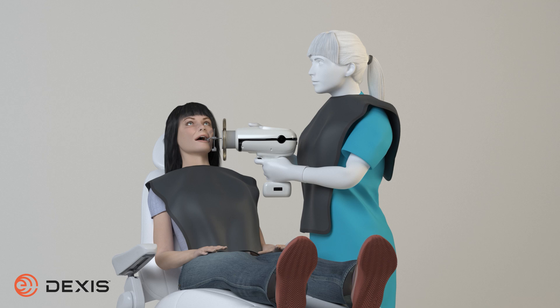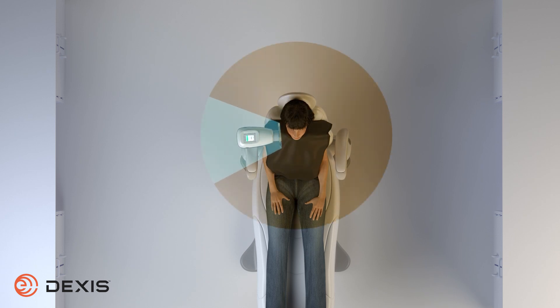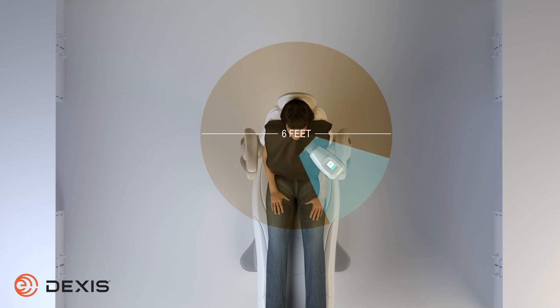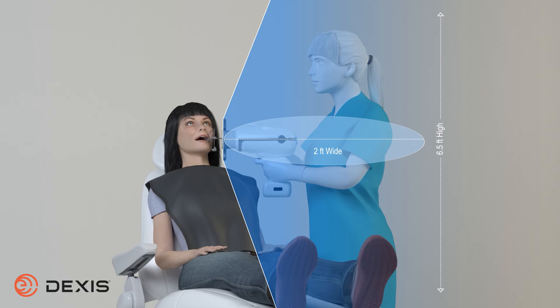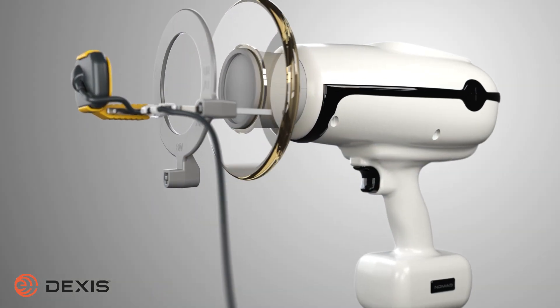Do not acquire an image if anyone other than the patient is in the direct area. Ensure all persons other than the patient and the Nomad user are at least 6 feet away from the direct beam prior to image acquisition. Hold the Nomad using two hands, with your elbows in for increased stability and increased patient safety. Avoid touching the patient with the cone or backscatter shield. Always sight through the shield and not over or around it.